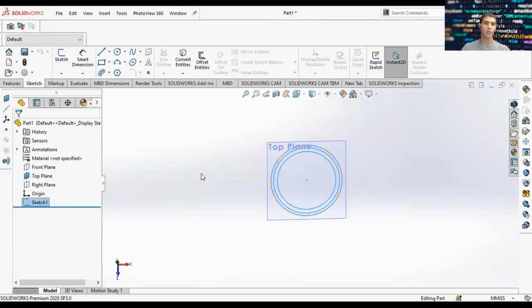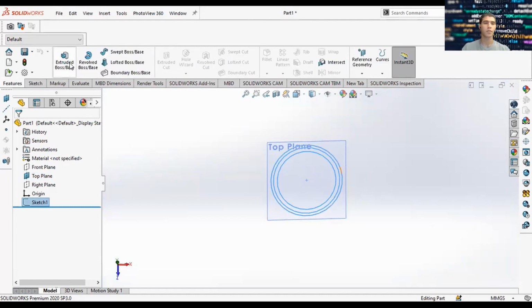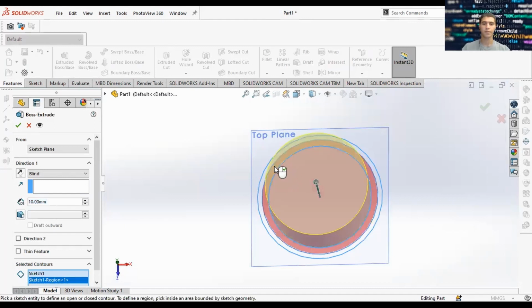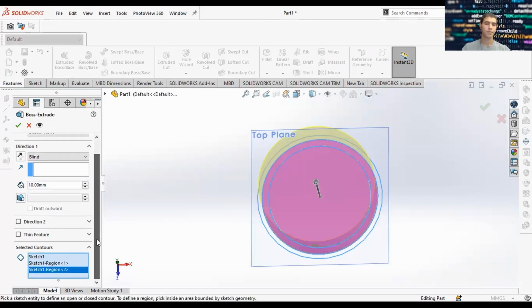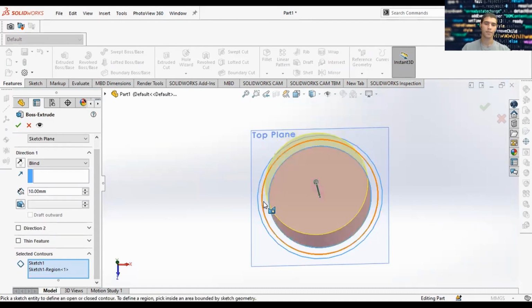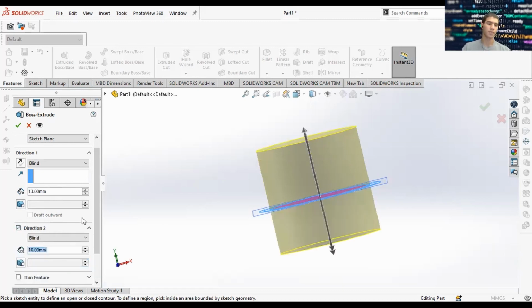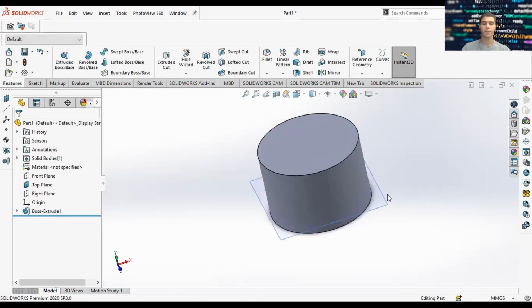So next thing you want to do is you want to extrude this. Go to Features, Extrude Boss/Base. And so you'll be extruding this part. We'll extrude upward 13. And we'll extrude downward 5. So now I have a cylinder.